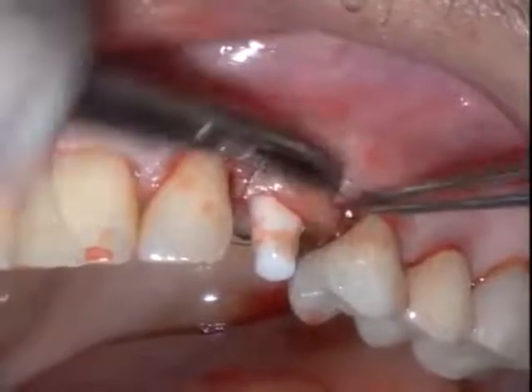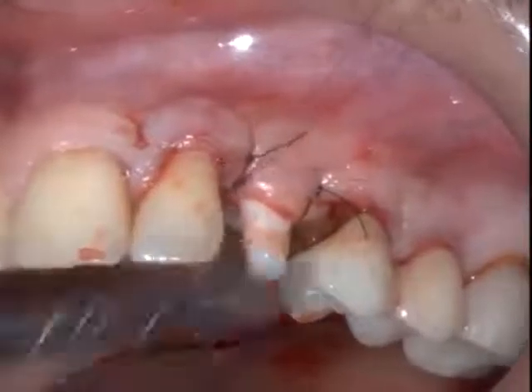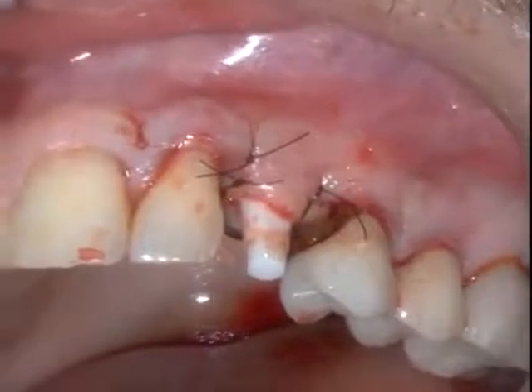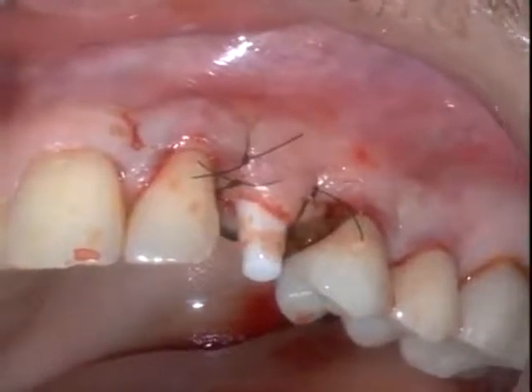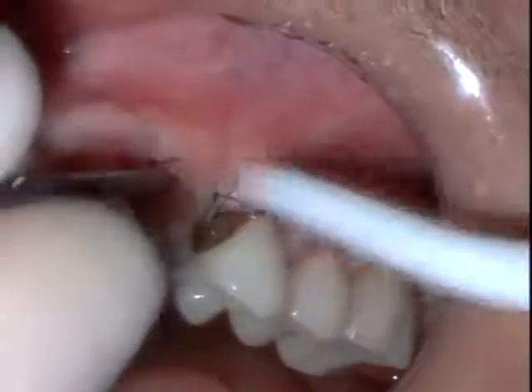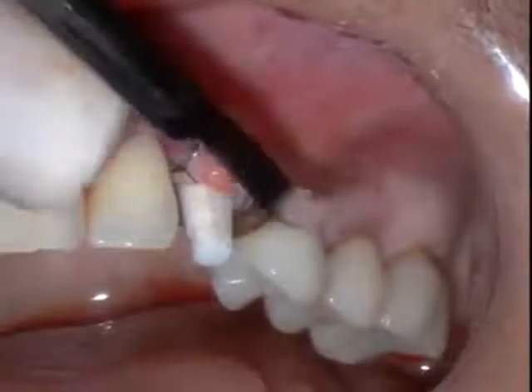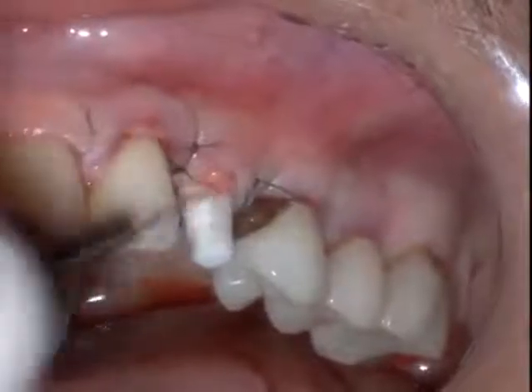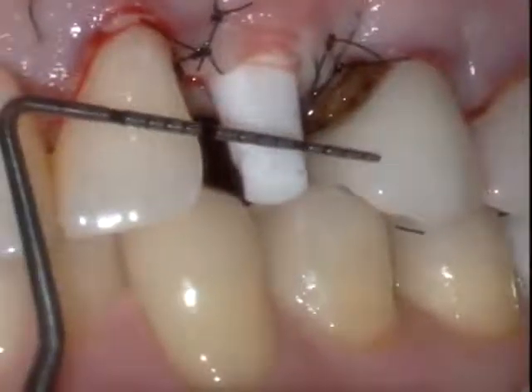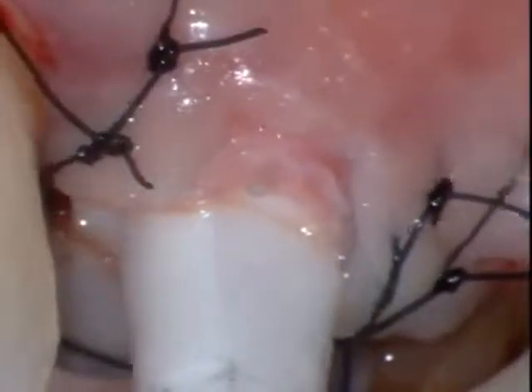A final suture is now utilized just to reposition the distal aspect of the soft tissue and to give us a very nice and tight adaptation of the overlying flap and the underlying connective tissue graft. The area is irrigated, the excessive soft tissue is excised, and this allows us now to have a better adaptation of the remaining soft tissue. We don't want too much of the soft tissue hiked up above the margin of the zirconium abutment.